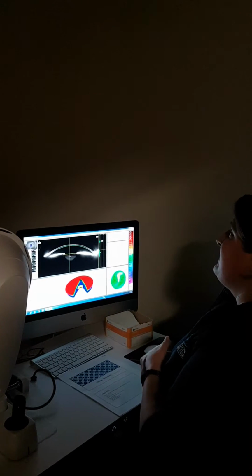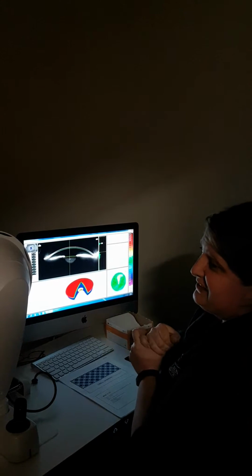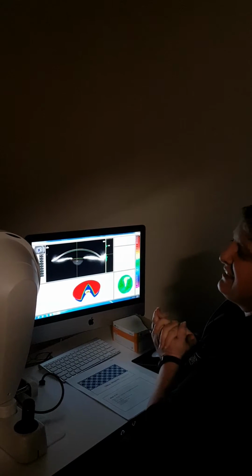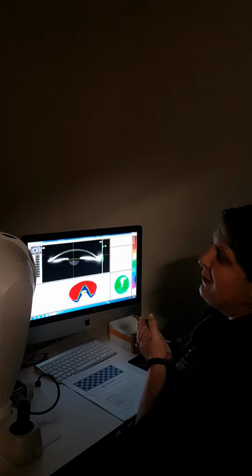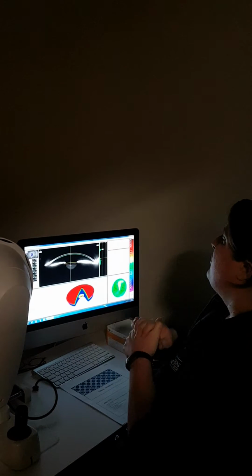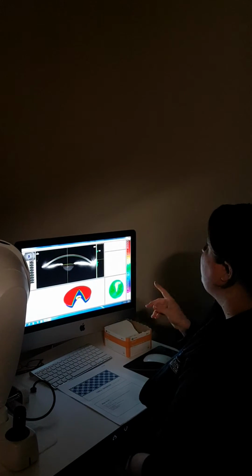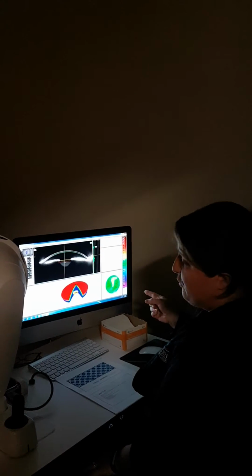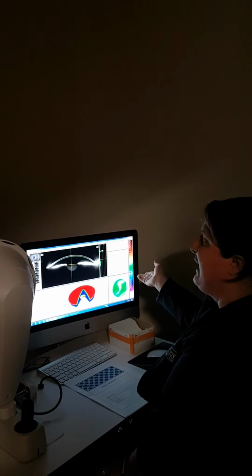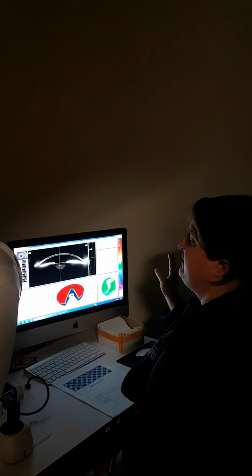Now, that's not to say that a red image is all you're going to be able to get for some corneas. It's really tough to get those PKP patients, and if the patient's not cooperating very well, not following instructions, it's really hard to get one. We'd rather have at least something than nothing. However, do be careful, because if it's red, sometimes it doesn't even generate your K values. If you don't have K values, it's a worthless scan. You wouldn't even need to send it.